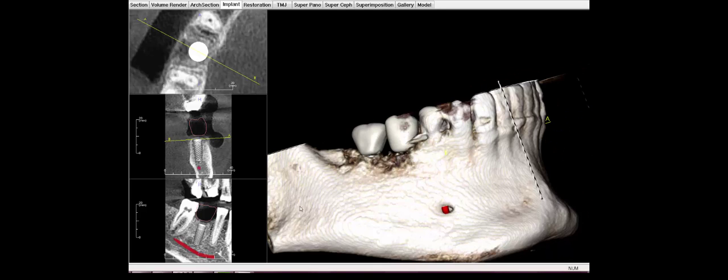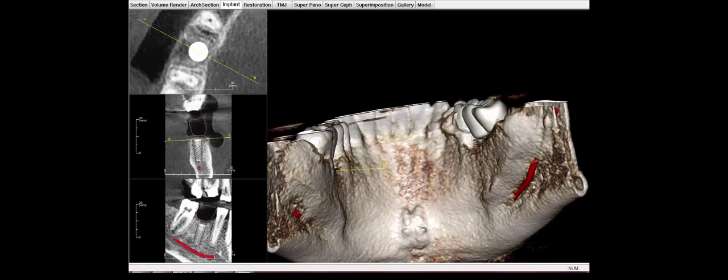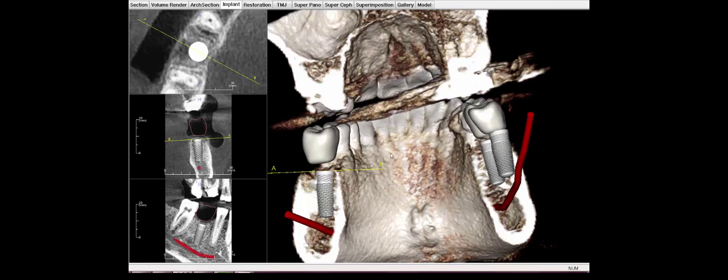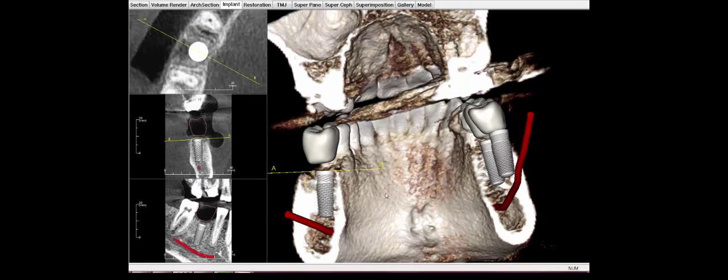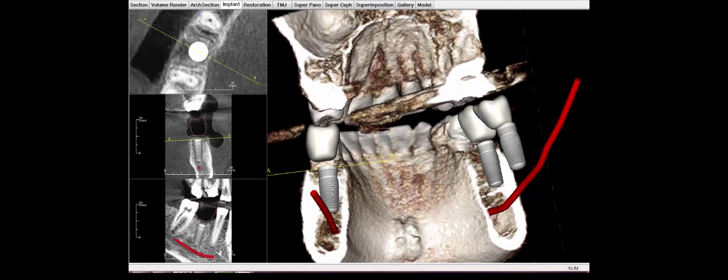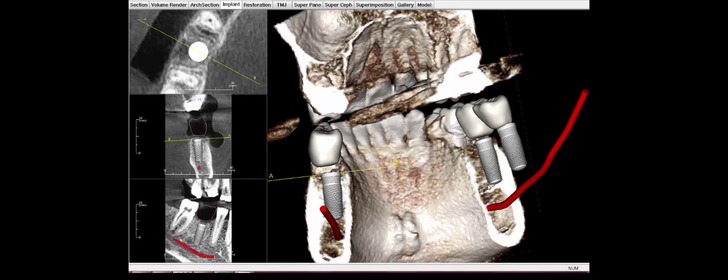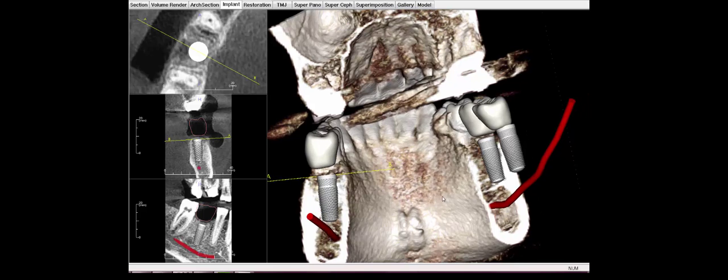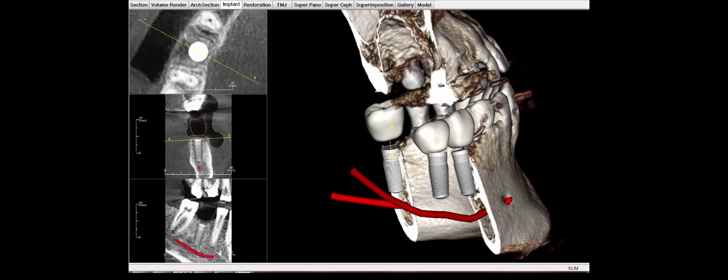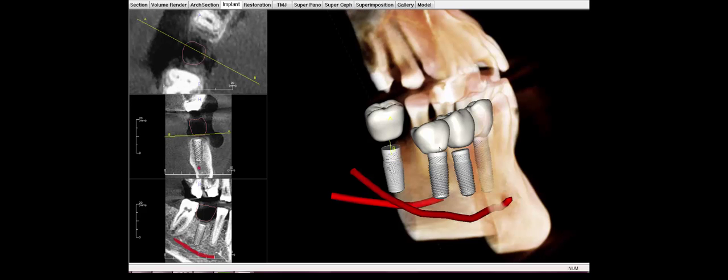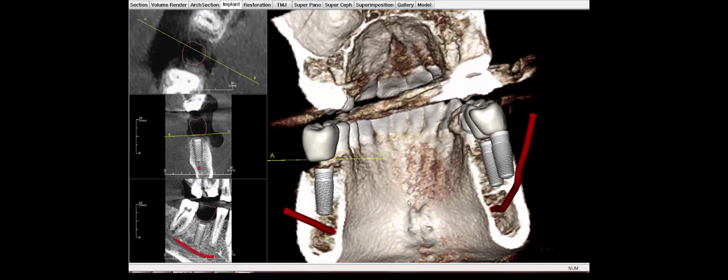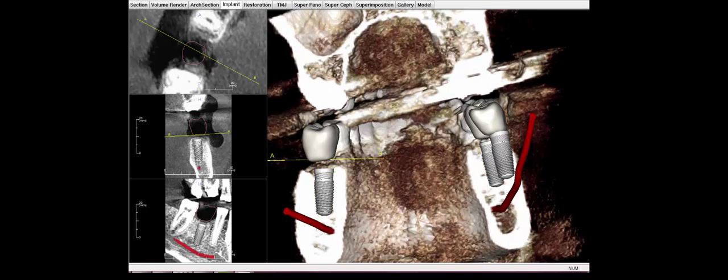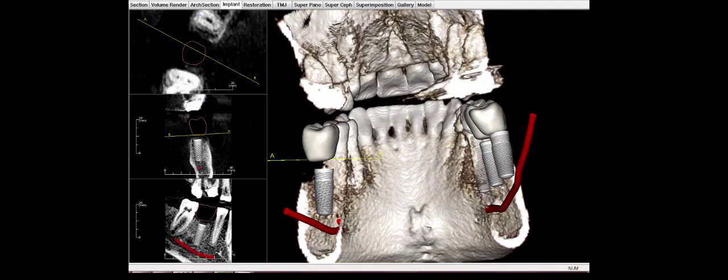But where we can really see the power of the 3D is when I take the patient in this dimension over here, I can actually see how I'm going to place the implant, how is the bone density, where is the marrow. You can see all the details in here. Here's a big hollow spot in the bone. Here's a muscle attachment where the tongue touches. The tongue muscle attaches, but look at the detail of where my virtual teeth are in relationship to the bone. And this is where it's really all at here, where you can see and plan and understand everything well in advance of ever doing any procedure.